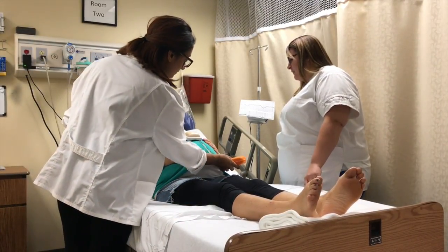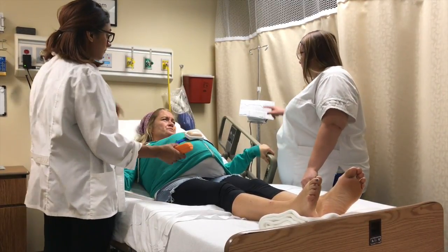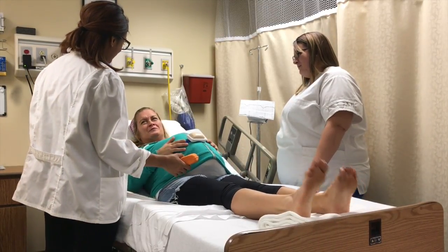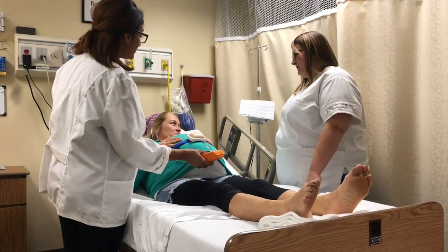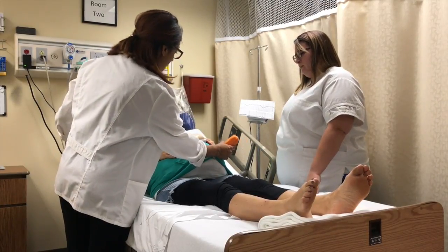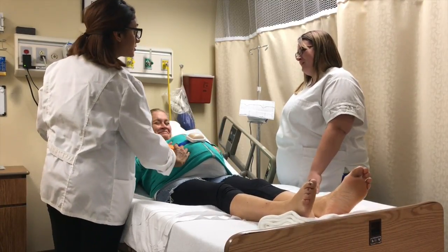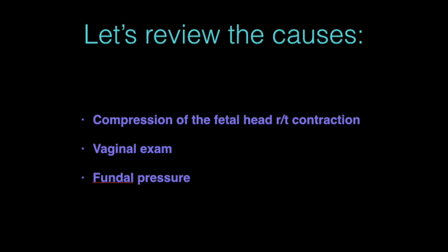All right. You might also be having some fundal pressure right now. Oh. So see how that dips a bit right there? Yeah. Oh, here it comes. Ooh. And then see, now it's back to normal. Yeah, that's usually how it happens. So I'm just going to check and make sure everything's all right here, okay? The umbilical cord looks to be in place. I know, I'm sorry. So that's not a concern right now. We'll continue to monitor you. Oh my God.